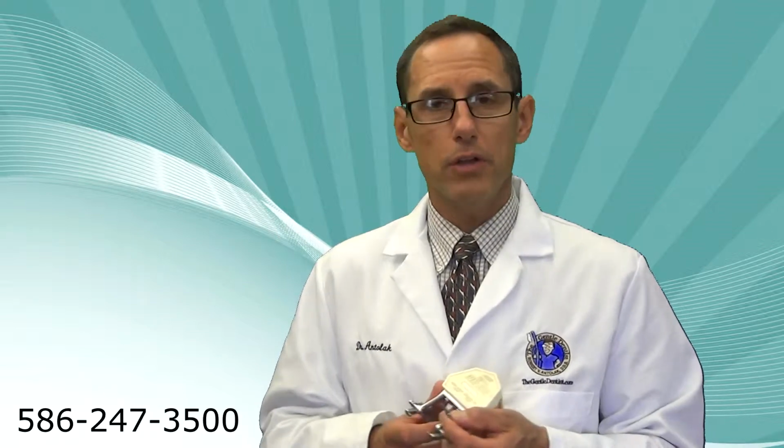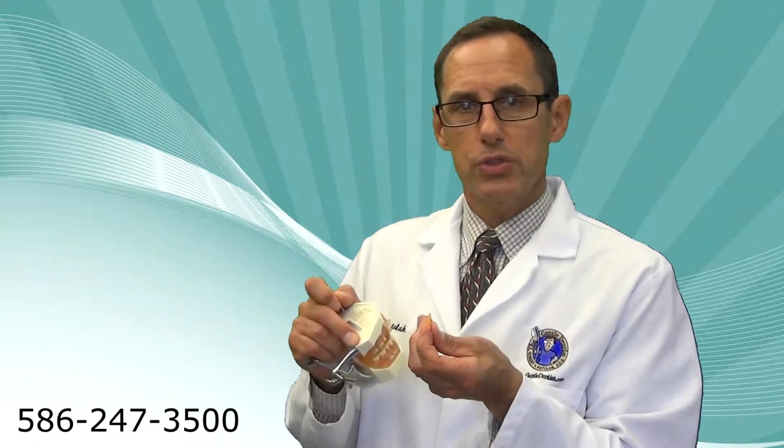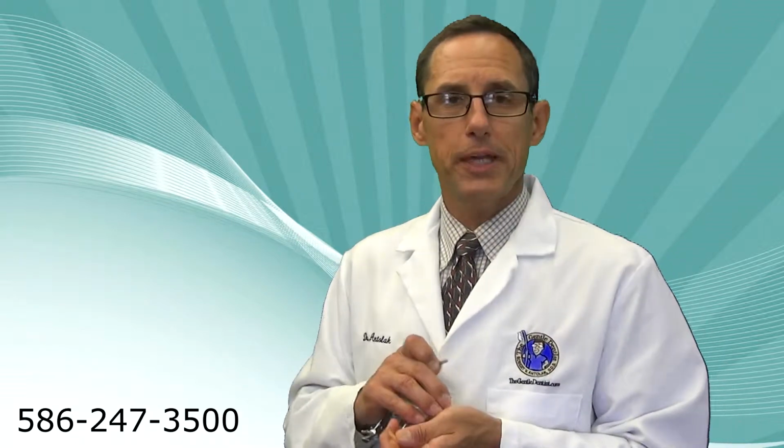Dental implants, like I say, involve really no discomfort to speak of, and they have been tested for a long period of time. One thing that does happen with implants is that they help to maintain the bone. Just like with a natural tooth, like I just pulled out on this model here, there are roots on there. Those roots, just like an implant, if they are in the jawbone, help to stimulate the bone from within, because bone is living tissue. That bone will maintain its health and integrity and not shrink down.